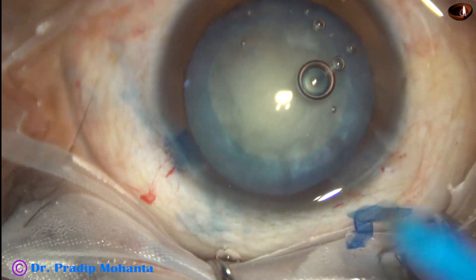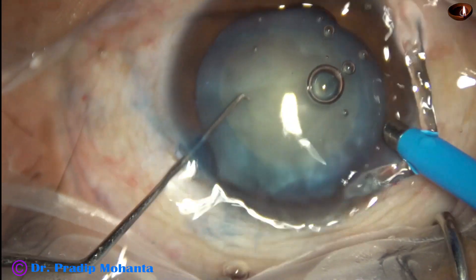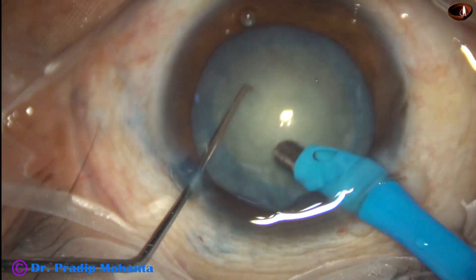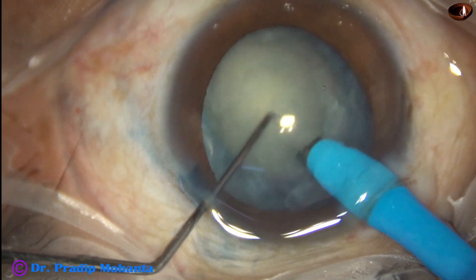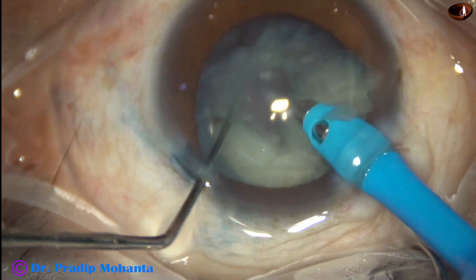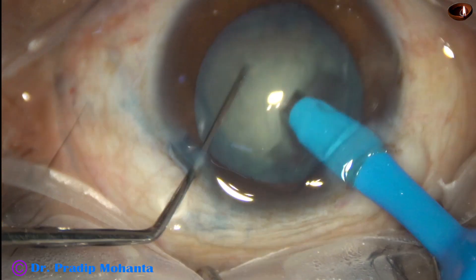Size of this rhexis is about 5.25 millimeters. The handpiece goes in — the machine is Faros from Oertli. The phaco needle goes in with its bevel down. Some superficial lens matter is removed, and then the handpiece is turned to make the bevel up. This is my technique: submarine chop. The phaco needle goes into the substance of the nucleus, and as it trebles, in this case there was a crack in front and the nucleus abruptly divided into two pieces.